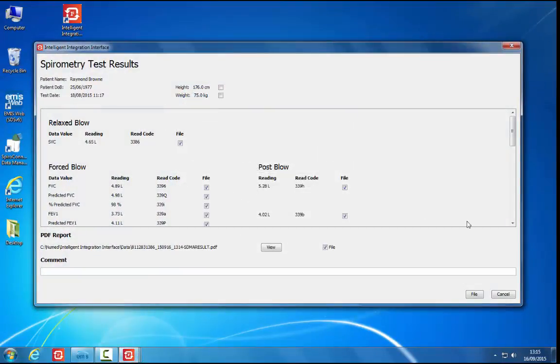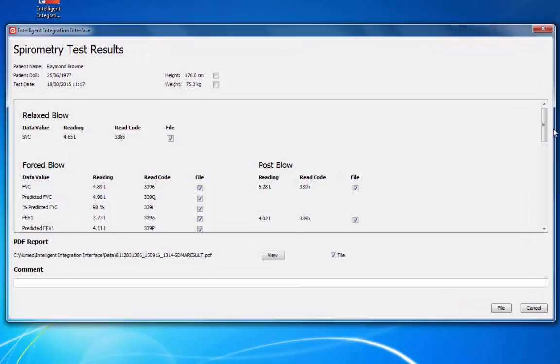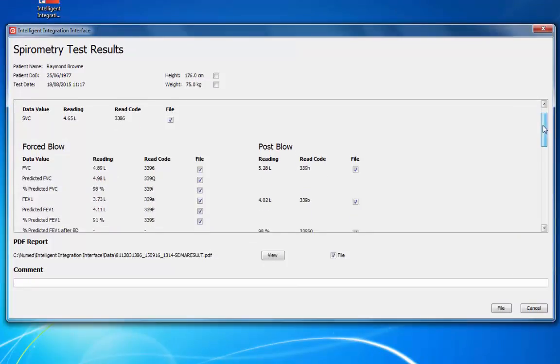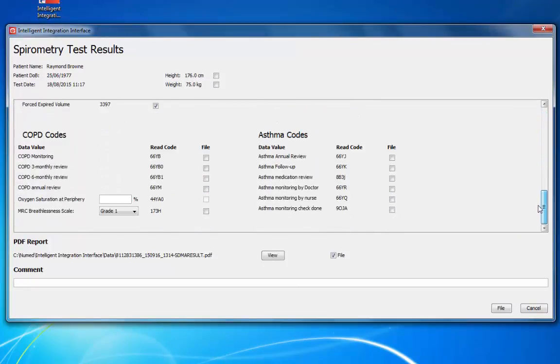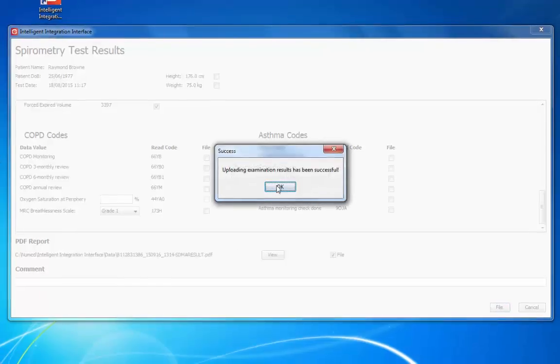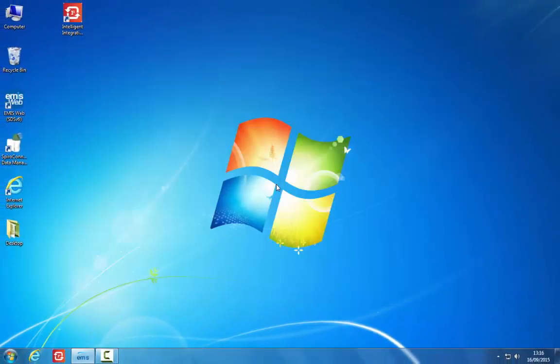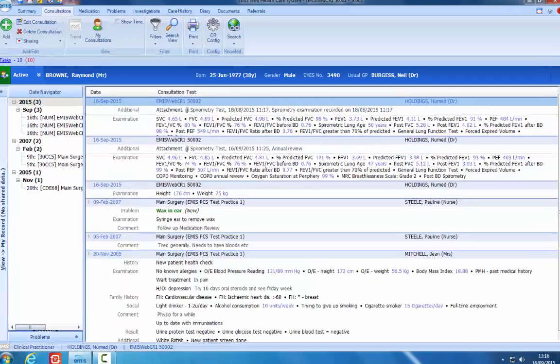The examination readings will be available in the i3 filing screen and the results are filed in the same way as shown earlier in the training video. When filing historic results, the date and time of the examination will be shown as a comment alongside the filed report.